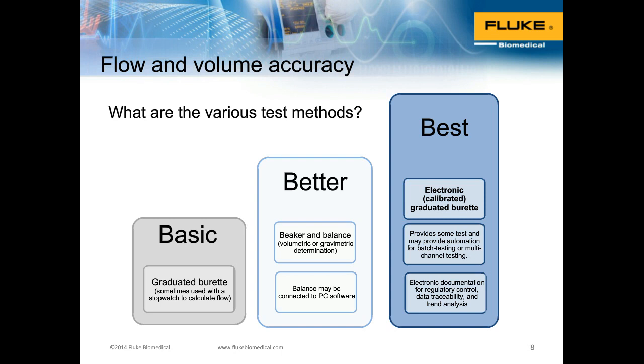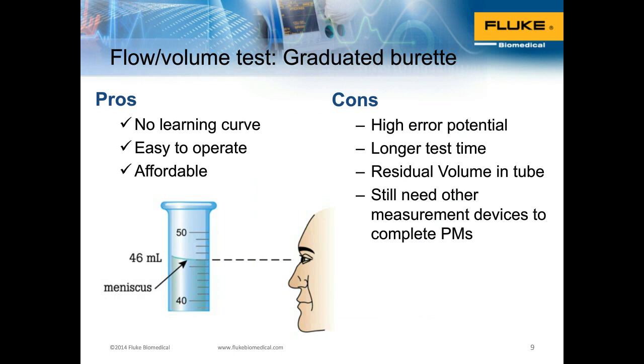Let's talk about some of the pros and cons related to the graduated burette. This is, of course, a very simple and cheap method to be used. There's no learning curve here. It's very easy to do. It's very affordable. But there are some things you need to be very careful about. There is an error potential here because you're essentially using a manual method, which tends to be prone to error.